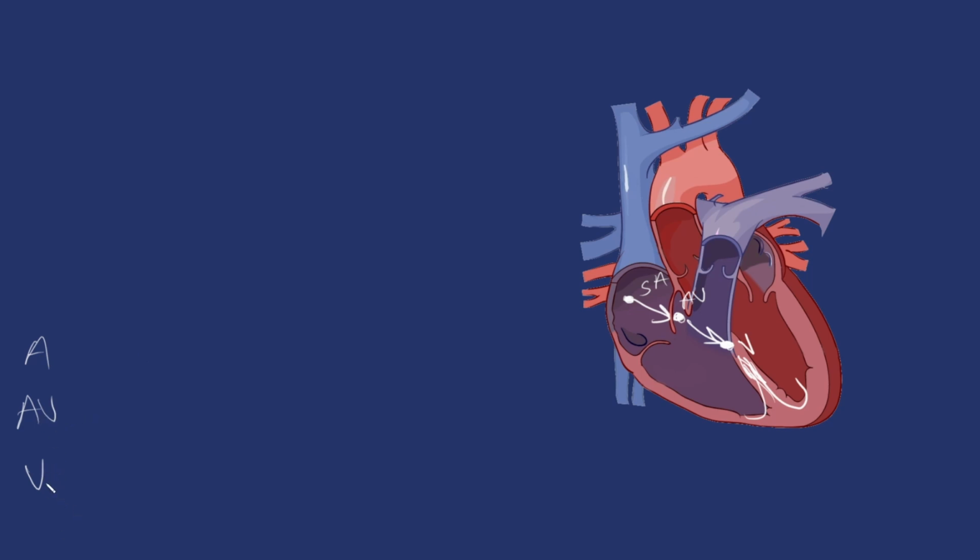There's some proper ways to do this as far as symbols and stuff you use. I'm going to do this kind of abbreviated in a way just to teach you this, so this way you can help to understand what's going on at each point, but we're not going to get super anal about it, okay? So the first thing we're going to do is we're going to draw out our EKG up above, okay?